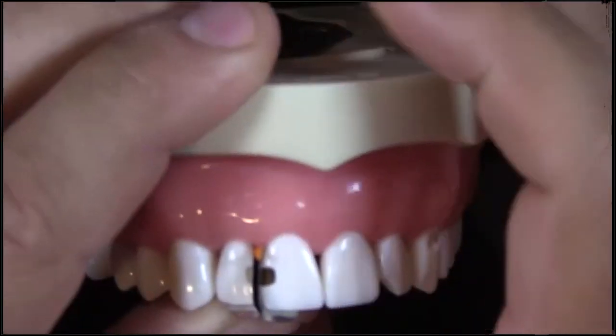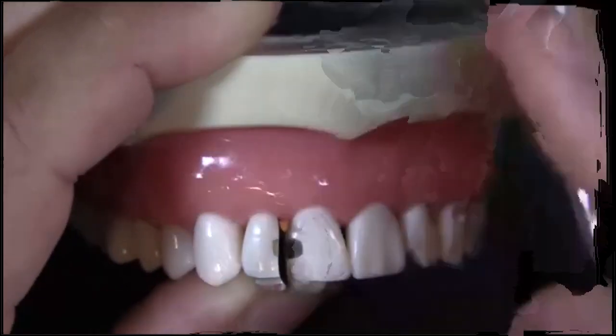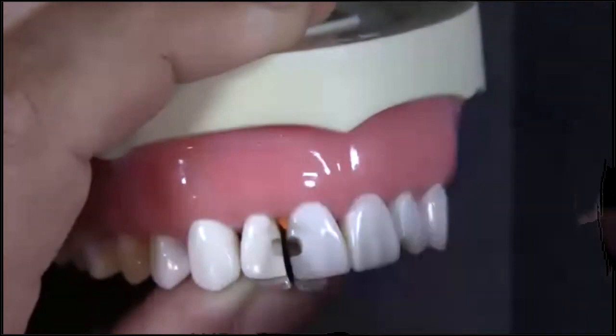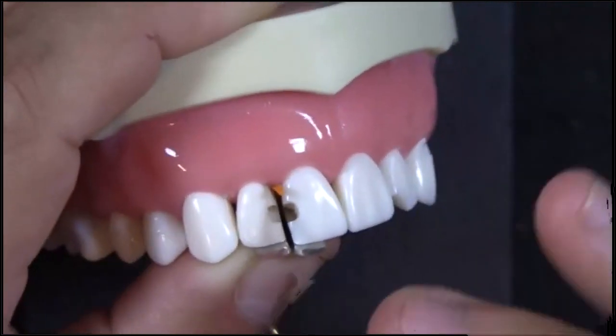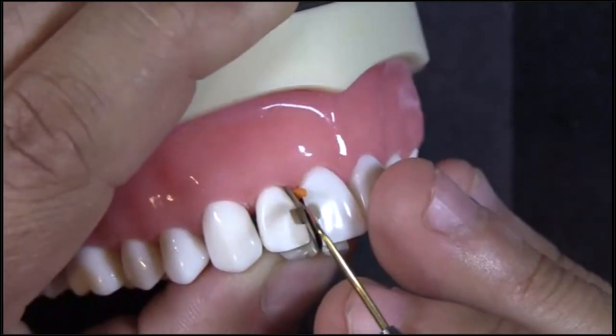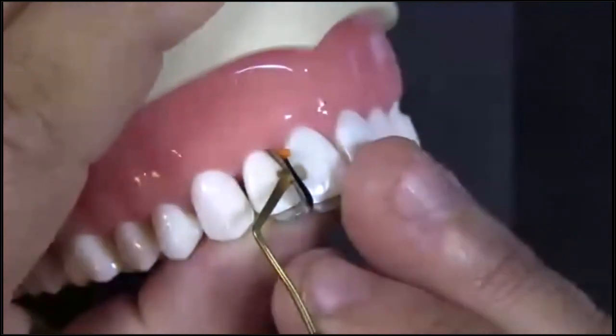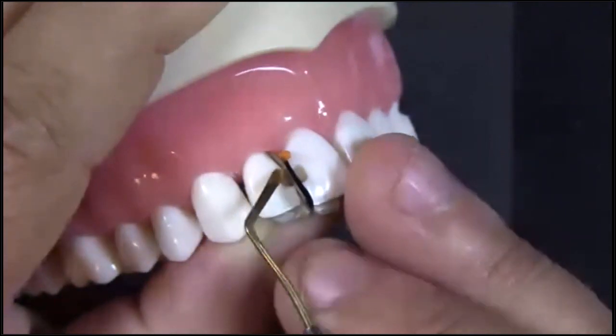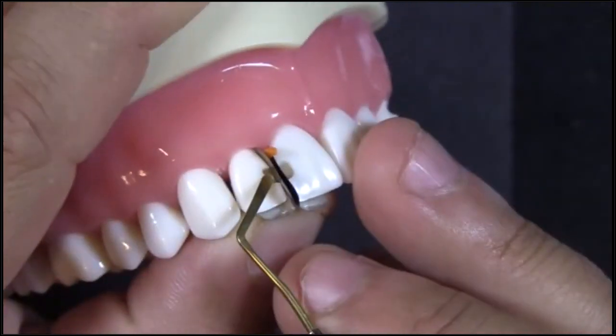What I like to do with these is put composite in, and then set my line angle. There are two different ways you can restore these: you can inject the composite, take a thin instrument like this, and kind of scoop the composite towards the facial surface. That's one way to do it and it works pretty well.